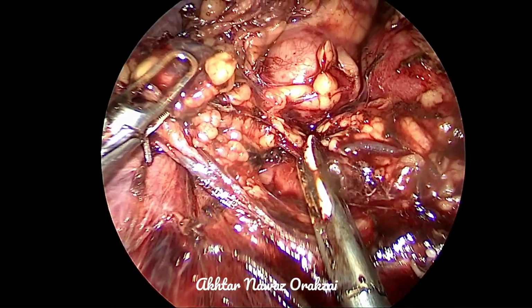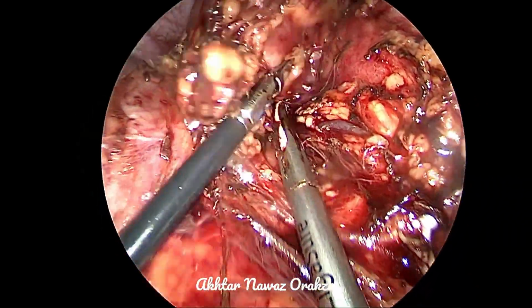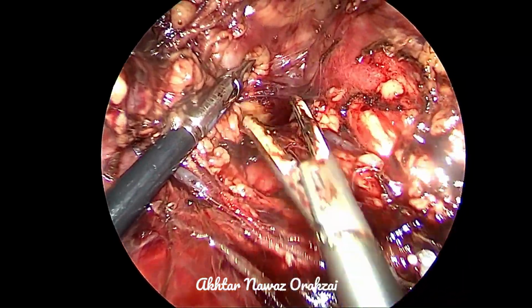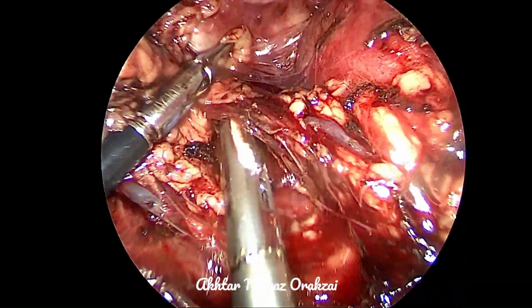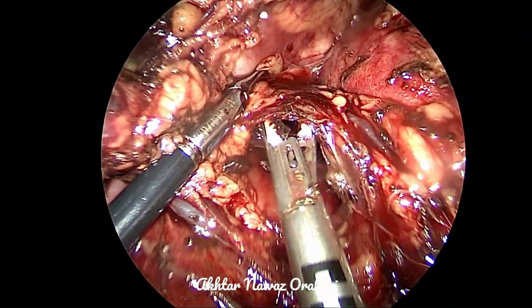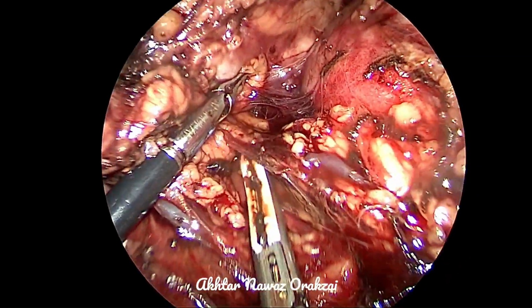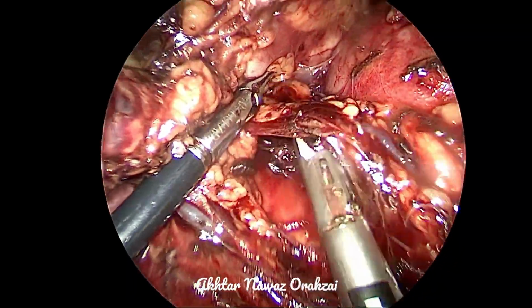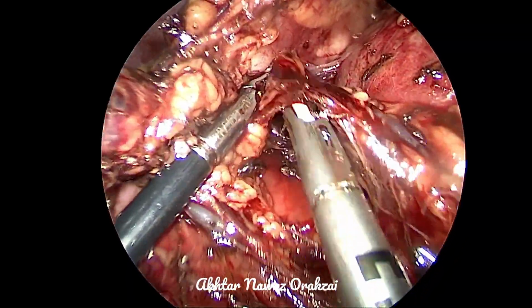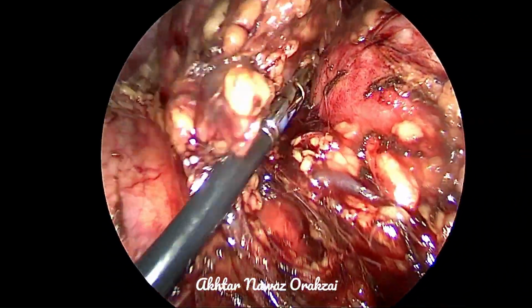We still can see the pulsations here. So we are going away from the renal parenchyma here and dissecting towards the adrenal gland. And this tissue most probably is containing one of the adrenal arteries, which may be a branch from the upper polar artery.